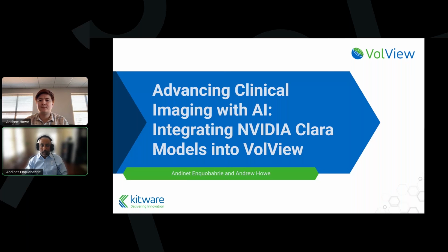Hello, everyone, and welcome to our webinar, Advancing Clinical Imaging with AI: Integrating NVIDIA Clara Models into VolView. I'm Andinet Enquobahrie. I'm a director here in the medical computing team at Kitware. I'm joined today by Andrew Howe, one of the VolView core developers. And Andrew will be showing a demo of the software and discuss how we can customize VolView for different applications.